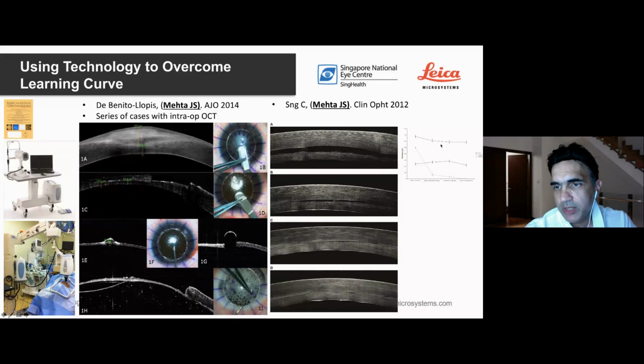This is shown graphically in the graph over here, where the tamponade goes with time, and this is 6 minutes. You can see here the space becomes very minimal after we do the drainage with the venting incisions as well. And this is one of the advantages, that we were able to tell intraoperatively what is going on with these grafts. Are these grafts sticking, and how are they sticking?